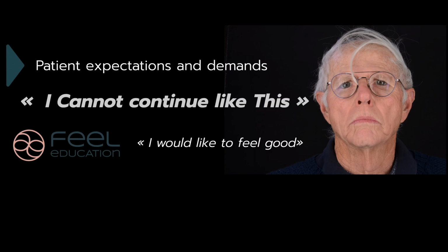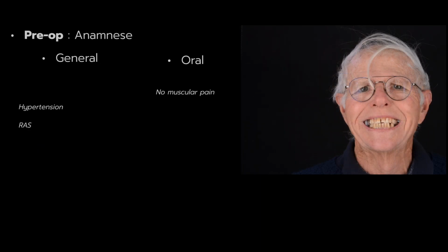What we want to share with you is the workflow. The 2D, 3D, 4D workflow is a way to organize your clinic so that you always follow the same process, and this is very important. The same process using digital tools. We know that digital tools are very important in our practice. However, we have to maintain all the time that the first goal is to treat our patient, to understand the values of the patient before using the digital tools, which is so important for us.